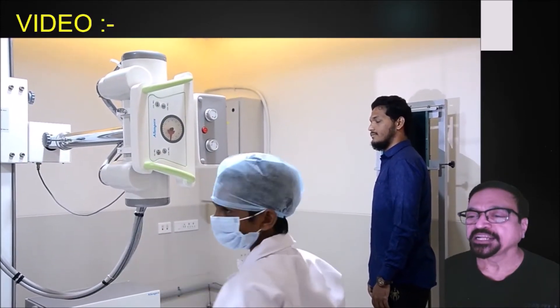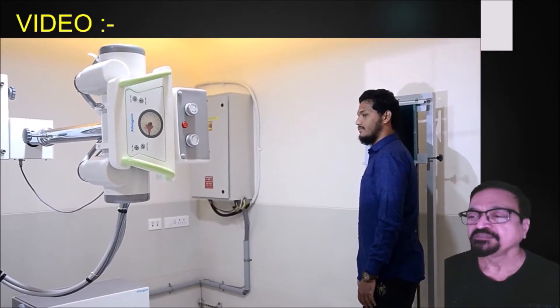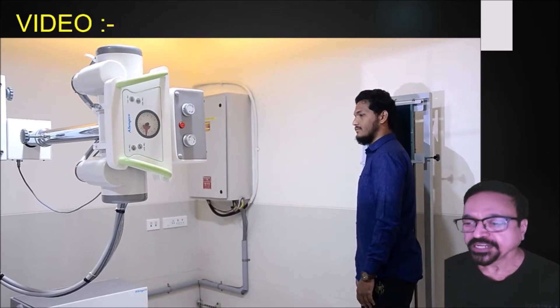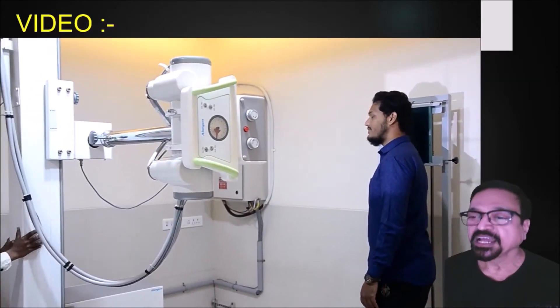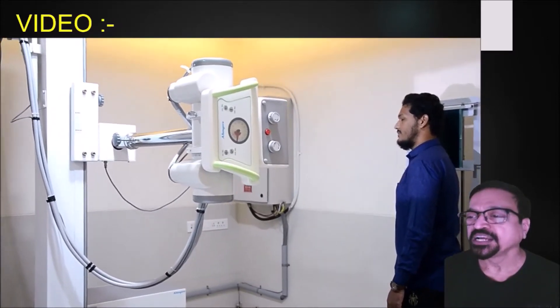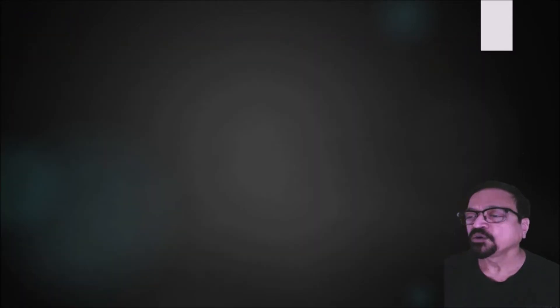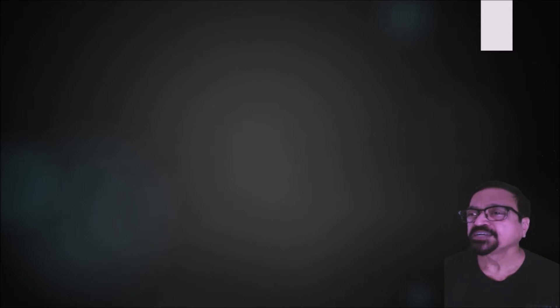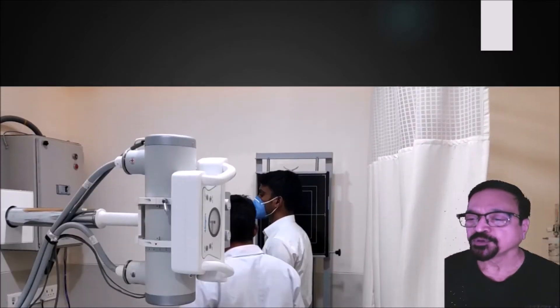Push the collimator in such a way that only the area of interest will be exposed without exposing other parts. It is extremely important that the full collimator field is never used. A senior person will come and do the collimation work so that the entire spine is not exposed — only the cervical region. We are not interested in exposing the dorsal spine, because it will not be seen clearly in this projection anyway.